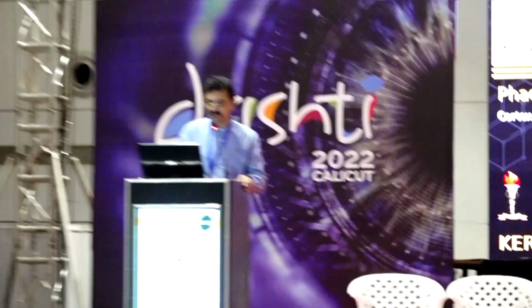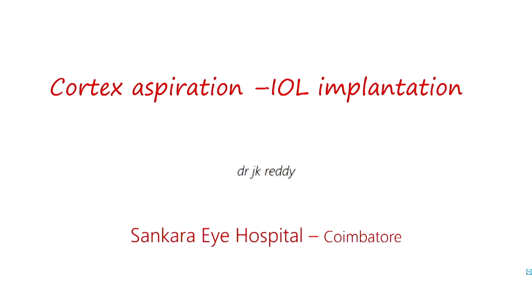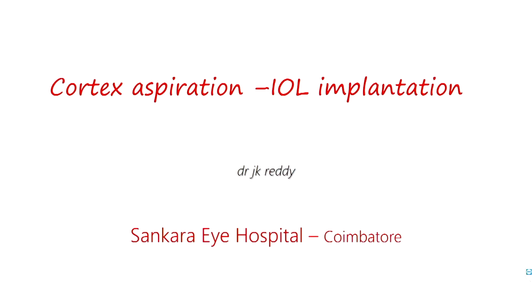Good afternoon. This is cortex aspiration and IOL implantation. When you look at all PCR cases and take the statistics from across, it's equal: the number of times the PCR happens in cortex aspiration or in the nucleus in phacoemulsification. As surgeons become more experienced, PCR is more common in cortex aspiration than in nucleus management. In the early stages of your learning, it is in nucleus management.